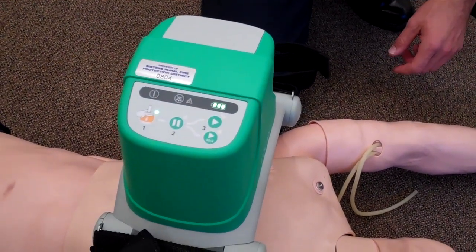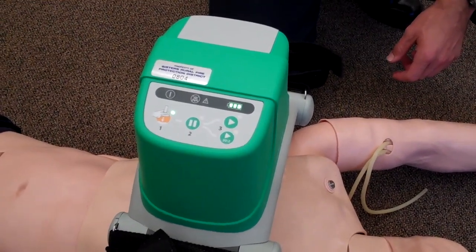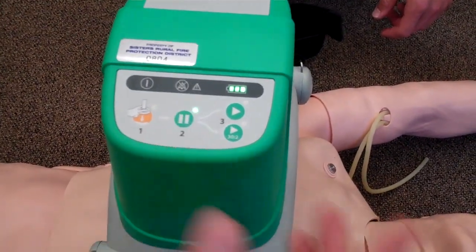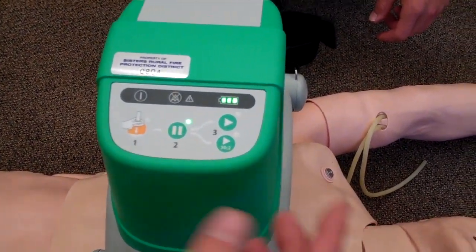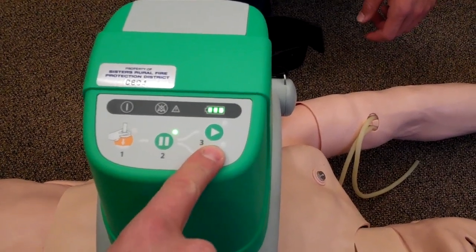The buttons you need to push are a numerical sequence. Start with number 1. After pushing number 1, move the plunger down into position. Second, push number 2. After number 2 is highlighted, select 30 to 2 compressions until an advanced airway has been put into place.